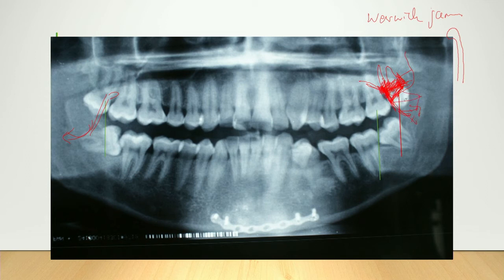It's very common with older and male patients, and you also have to look at their build. The tooth might look very, very simple to take out, but you have to look at the bigger picture, what the patient looks like themselves. If they're a 6-foot guy, a basketballer, and the wisdom tooth looks like this, it may still be difficult. If you put a luxator on that and push too far distally with rotation, this whole section will fracture. Okay, and what to do?